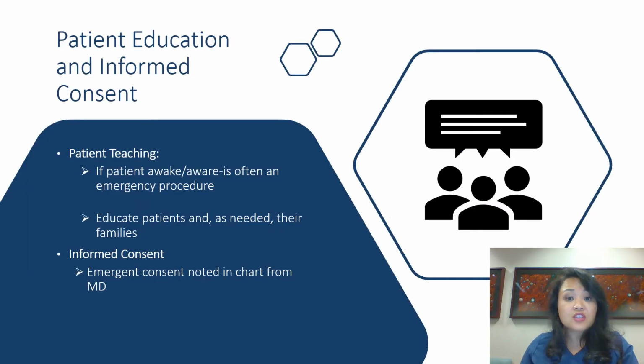So if the patient is awake or aware, you will want to provide teaching prior to insertion. That includes information about the procedure, what to expect, and information on central line associated bloodstream infection prevention. Oftentimes, the central line placement can be an emergent procedure, and the teaching may need to occur after the line placement when the patient is awake and aware.